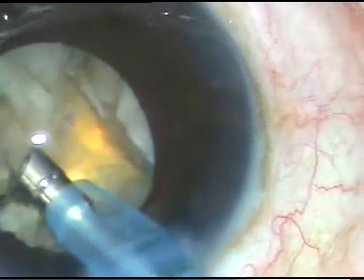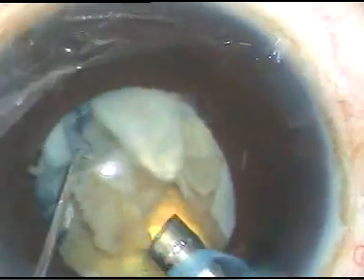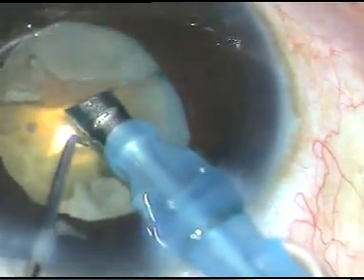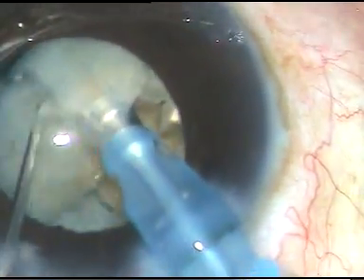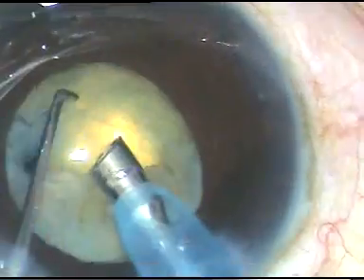Now, the rest of the nuclear mass has been cracked by several chops, but still the posterior plate is leathery and the fragments are not free. So what I am doing is, I am just trimming the periphery like this — trim the peripheral part of this mass and keep the central plate intact. This is another portion; trim this peripheral part. Now I rotate it and trim this portion. Let the central plate remain. And now, this is the central plate joining the fragments.